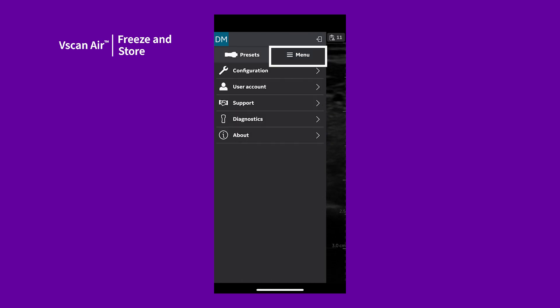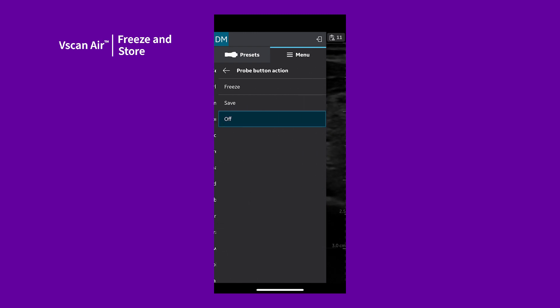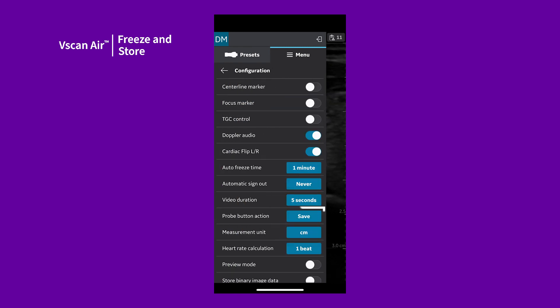swipe to the right, tap Menu, and tap Configuration. Select the Probe button action. This configuration allows you to set the Power Action button on the vScan Air probe to freeze or save. This can be useful to eliminate the need to touch the display device during procedures.